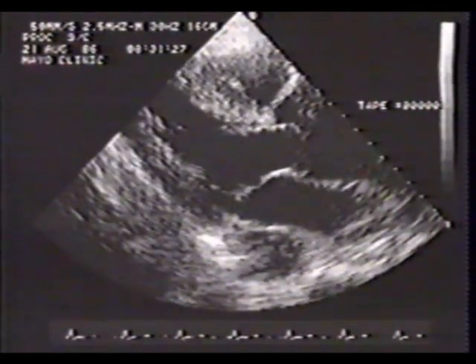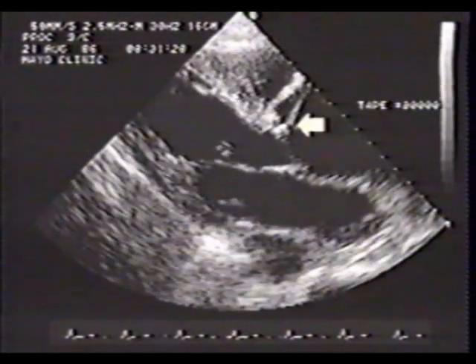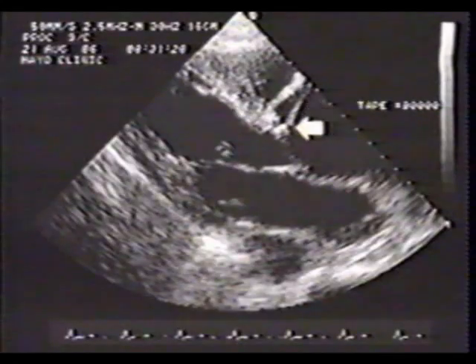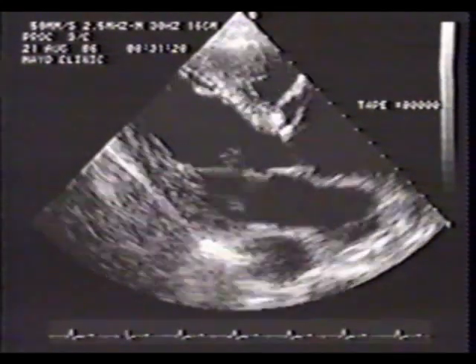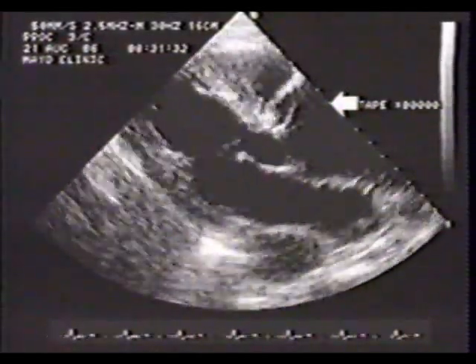On peristernal long axis imaging, the aortic root is enlarged. This is an intimal flap just above the aortic valve. The flap moves back and forth during the cardiac cycle.